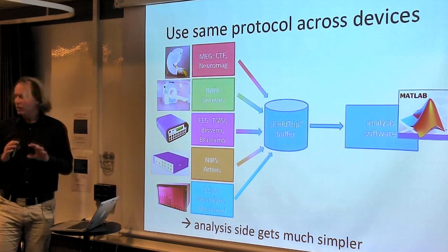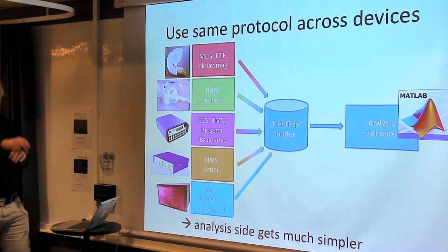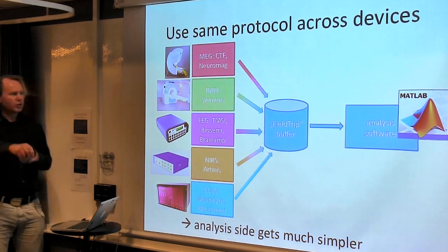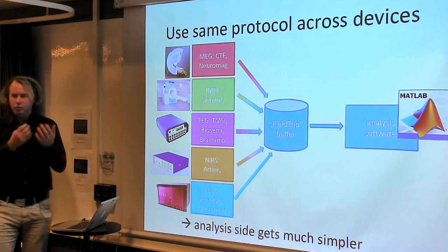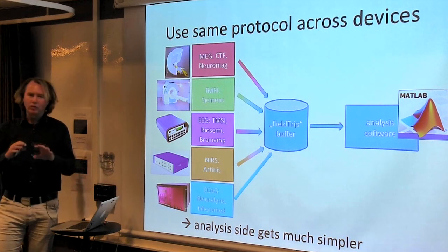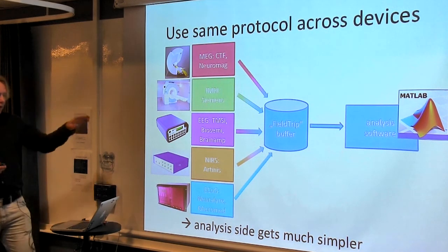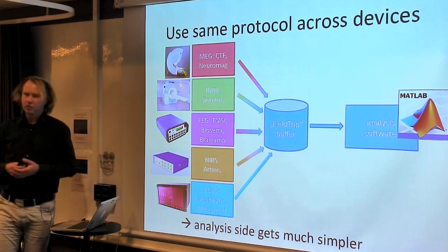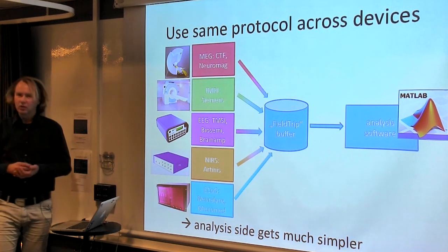But I should directly state it's not a MATLAB-specific buffer. It's a low-level interface to all of these acquisition systems. What it offers is a uniform interface to the programming language that you want to use for accessing this data. An initial programming language that we targeted was MATLAB, because that's what we're familiar with in Nijmegen. The consequence of having a single interface is that the analysis side gets much simpler, because a lot of these signals have very similar characteristics.